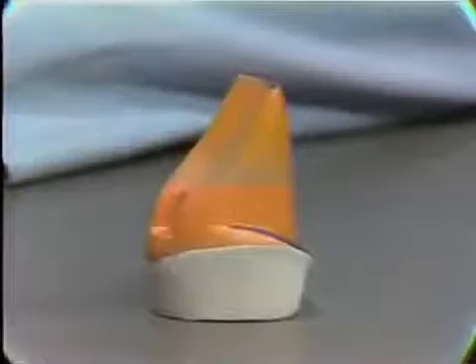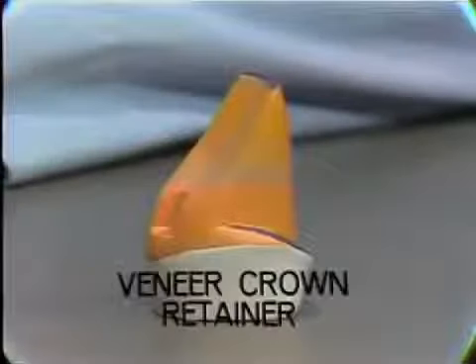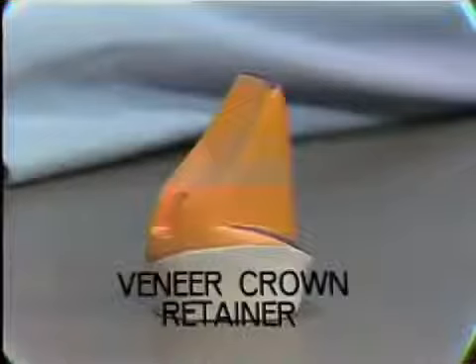That completes the review of the several types of anterior and posterior three-quarter crown retainers. And the next type of retainer, which we should go on to take a look at, is the veneer crown retainer, of which you see a model here.